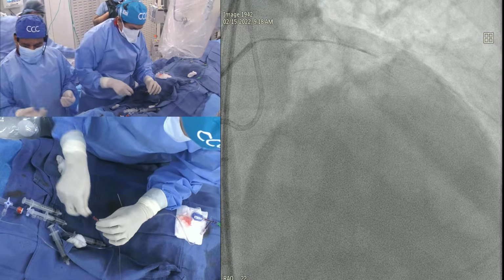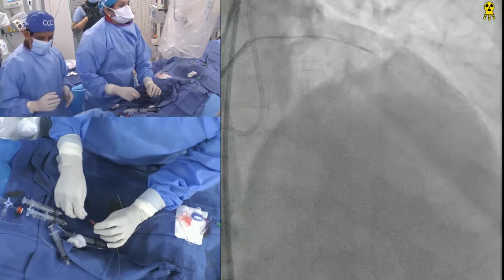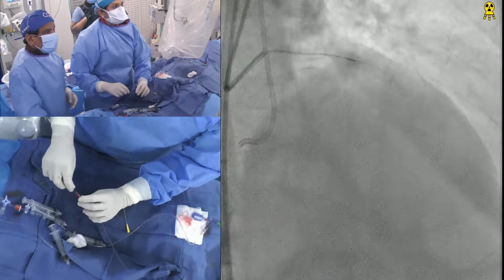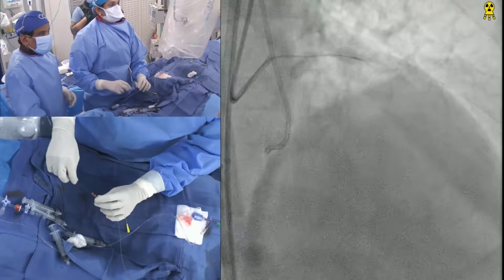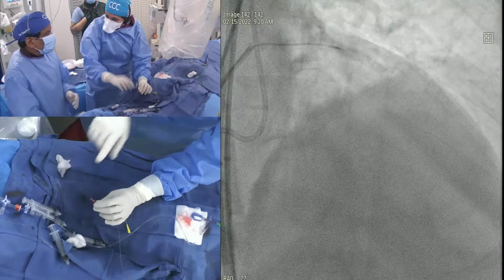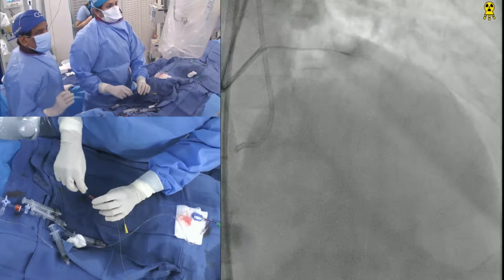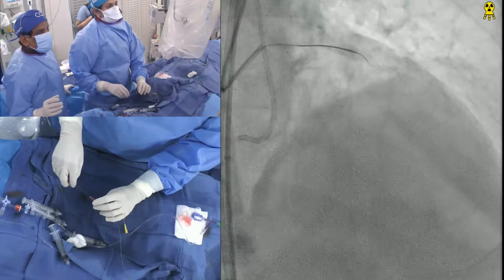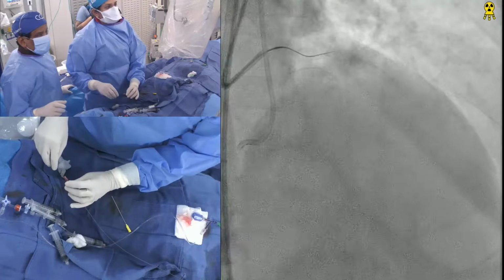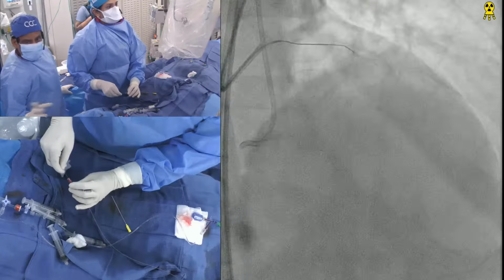All right. So we'll give it a last try. Question is, you still want to try once again the distal wire into the third septal? If the LAD is going into the diag, right, that's why I think this is not going through. Yeah, I know, but the same way I'll destroy everything. We can just do the balloon there if that is the case. See if this wire goes. I would still go to the third septal. Okay, fix it. Tell them.